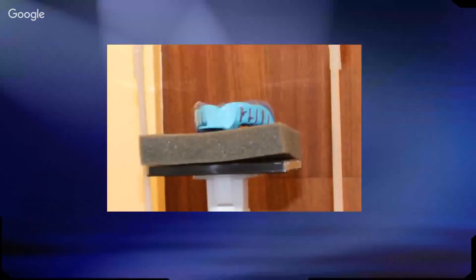If you have a platform that shows up radiographically, you can use a foam pad to create separation between the impression and the platform. So make sure that there is separation, or else this technique might not work so well. So once that's done, you can take these two data sets, these two DICOM data sets, and merge them in the Blue Sky software.